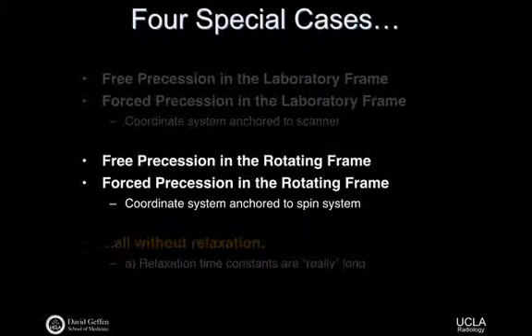Inertial frame, right? And a rotating frame is not an inertial frame. Then you have a non-inertial force in it, right? Yes. Then it acts like the minus term. That's a very physics description, but same. The point is that they are going to cancel out each other, but they cancel out because we've defined what system we're talking about in the first place.